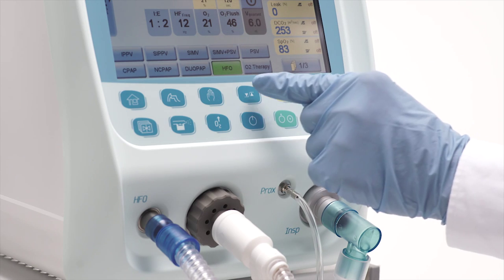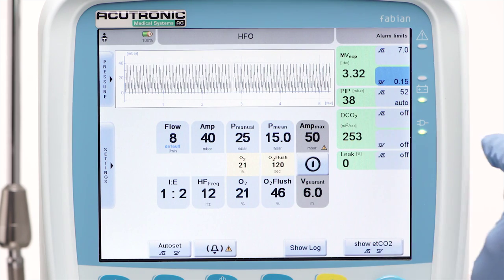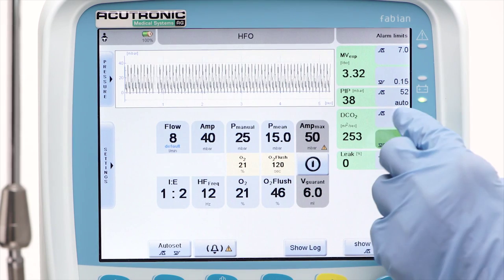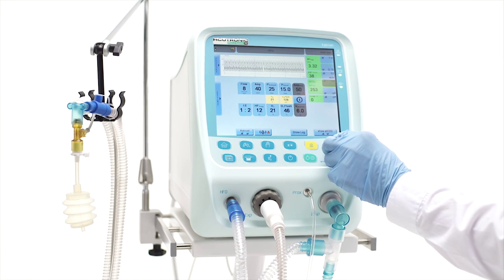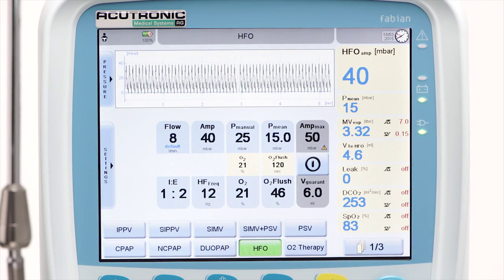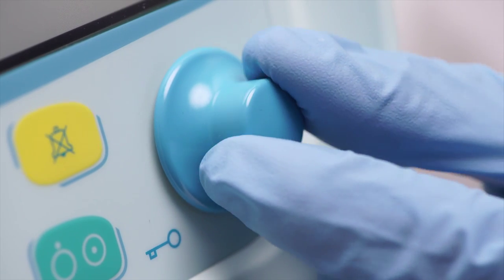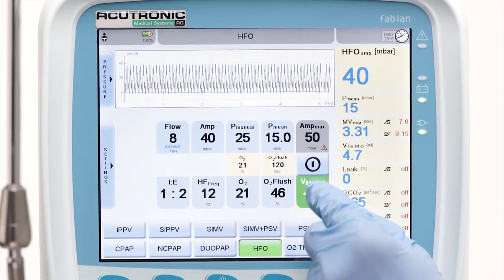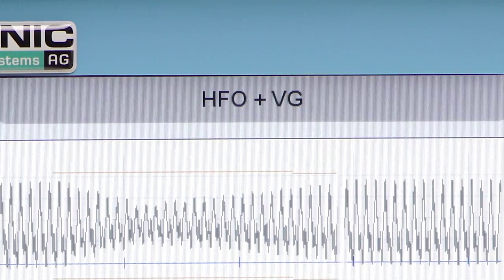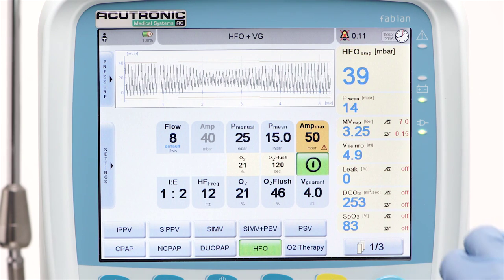Alarm limits on fundamental parameters in HFO can be adjusted, for example the upper and lower limits on DCO2. If volume guarantee is required, the target volume in HFO must be adjusted according to the infant's body weight and lung disease. Press the V-guarantee button, adjust the setting with the rotary knob and confirm. Then activate the V-G function by pressing the on-off V-G button.